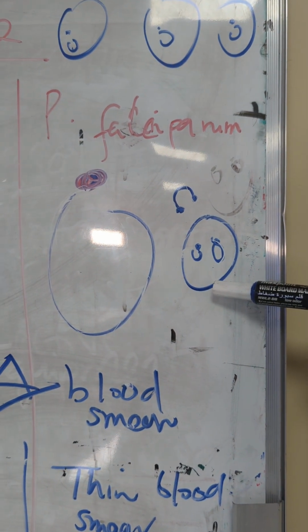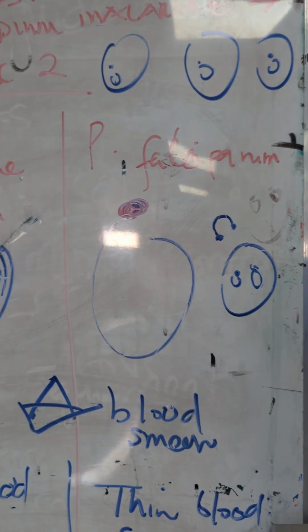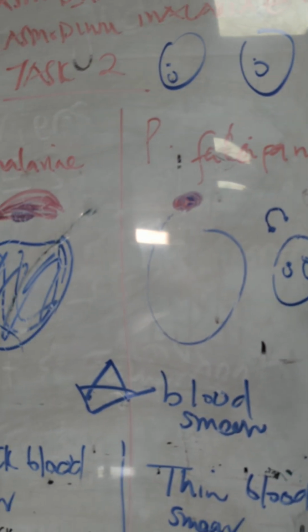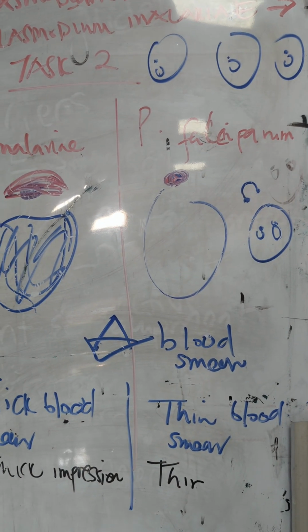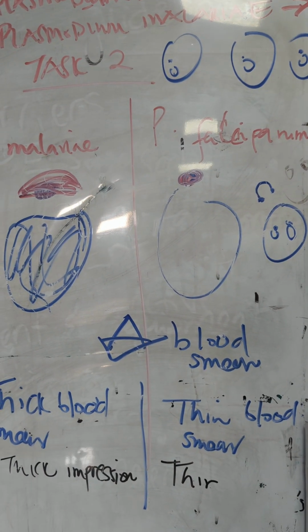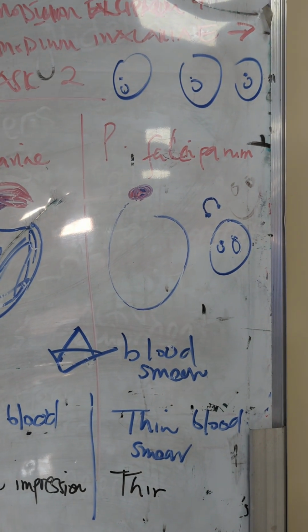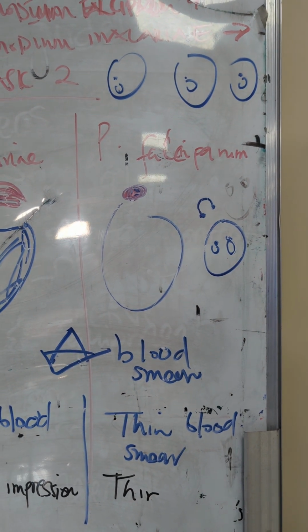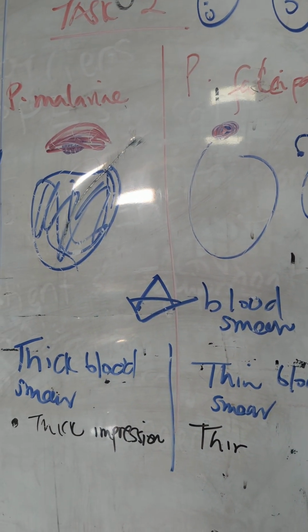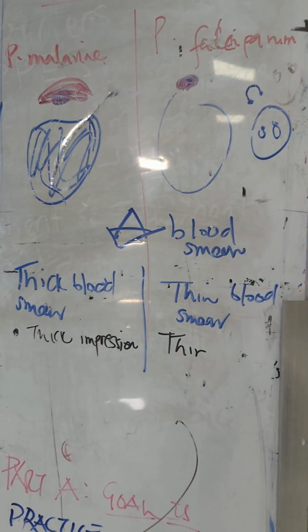So these were the pointers that I gave you after you knew how these trophozoites look, and now forming up the picture of how the count is done for the asexual stages, the trophozoites, the schizont. And so this was it. Once you identified how this trophozoite looks, you could actually appreciate how the count data was generated.